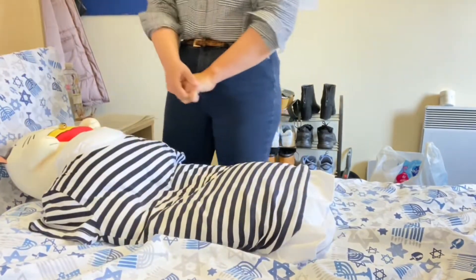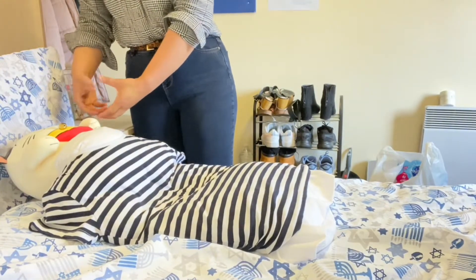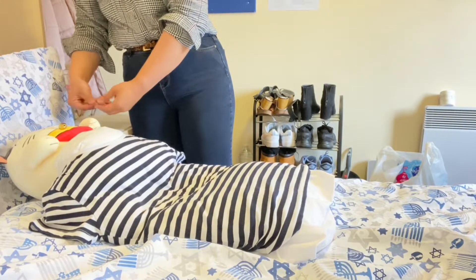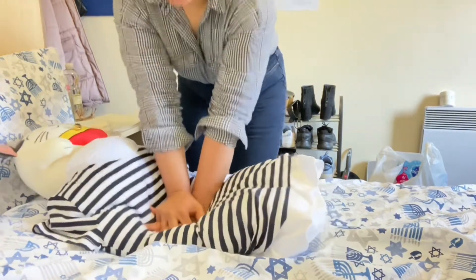I will keep breathing. 1. I will check for the chest rise. 2. And I will do my compression.